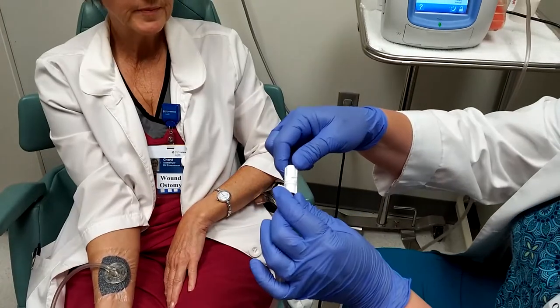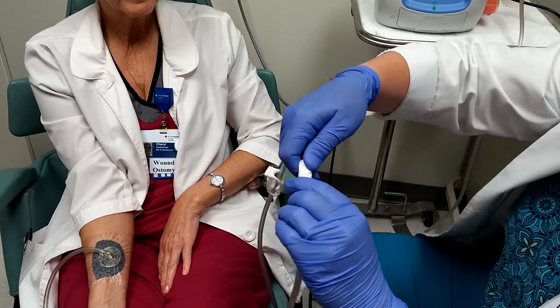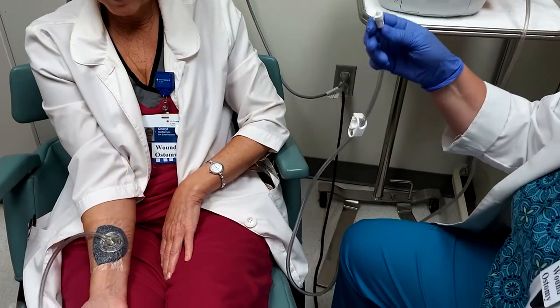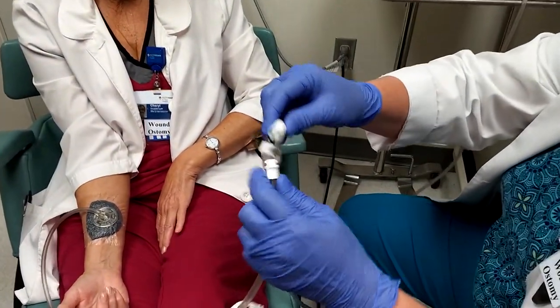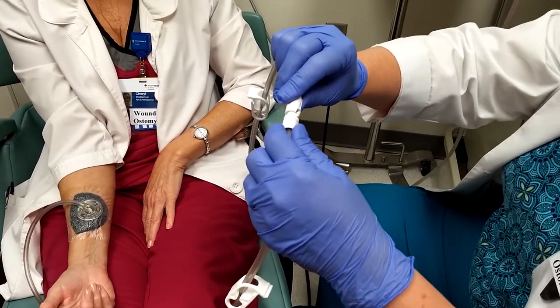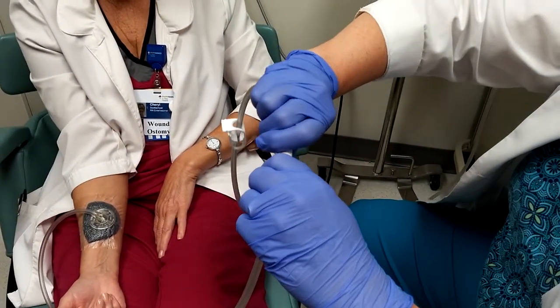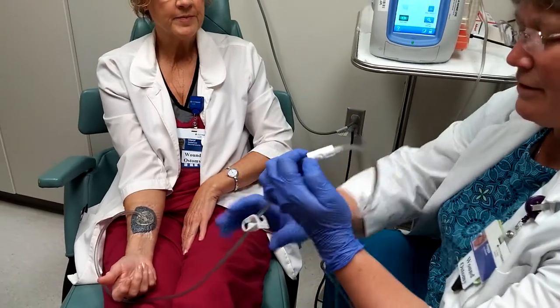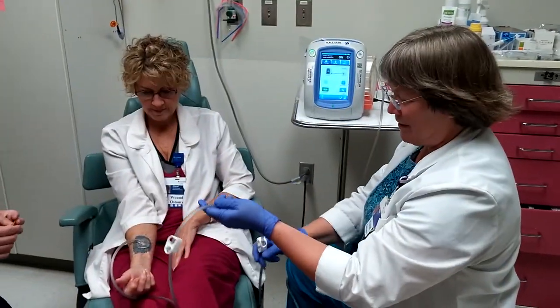This is the vulnerable part of the whole system, so push in and turn, just like a luer lock that you're doing anything else with. Go ahead and put it through whatever you need to put it through, but this is the fragile part. If that breaks, you need to get a new canister. Then push in and twist and it's back together.